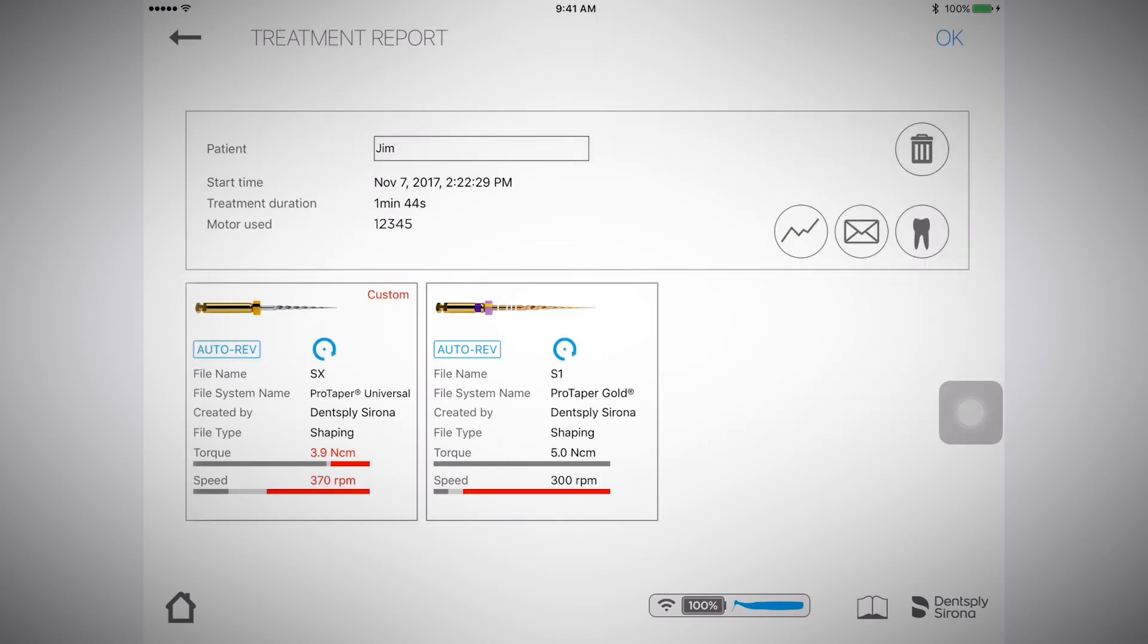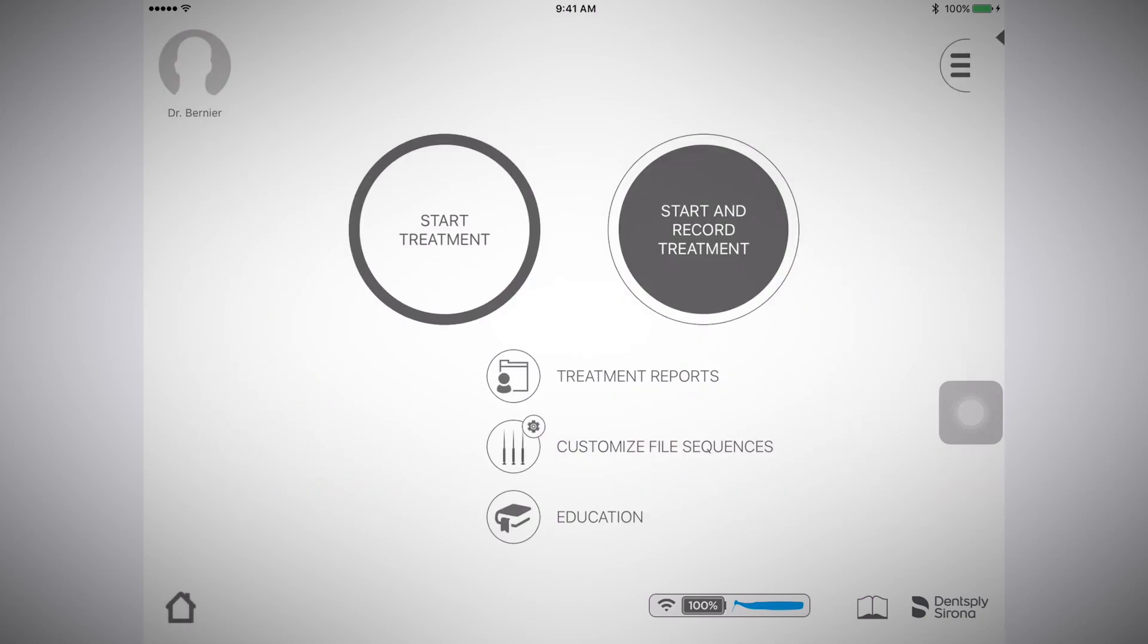The treatment report will be saved to the app under the patient ID, or you can email a PDF of the report by selecting the mail icon.